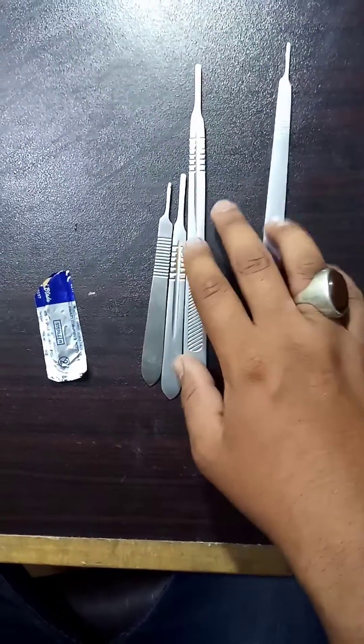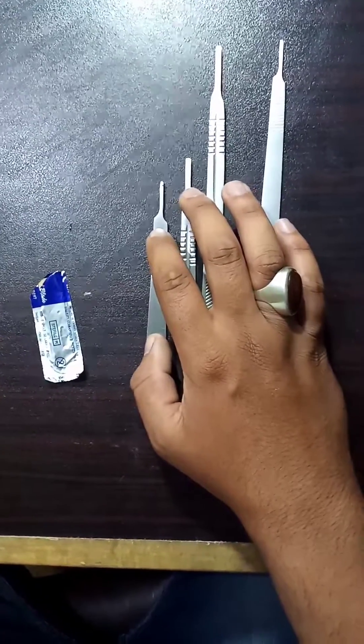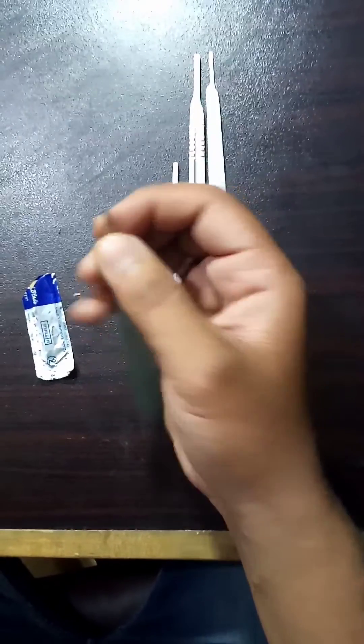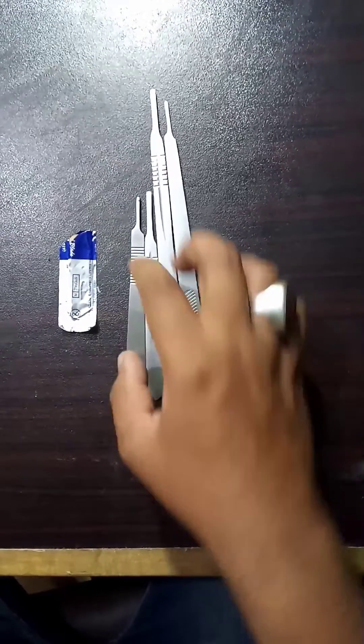This is number three, this is number four L, this is number four, and this is number three. A scalpel is a very sharp knife made to be used for surgery. The blade is replaced for use sometimes.